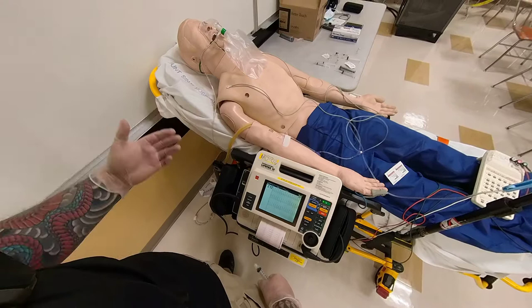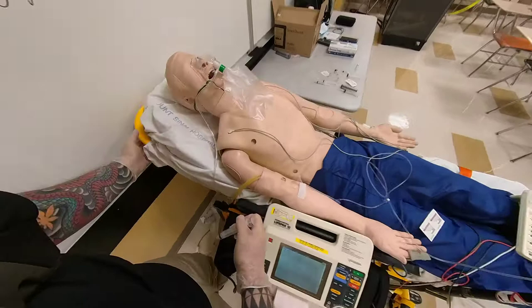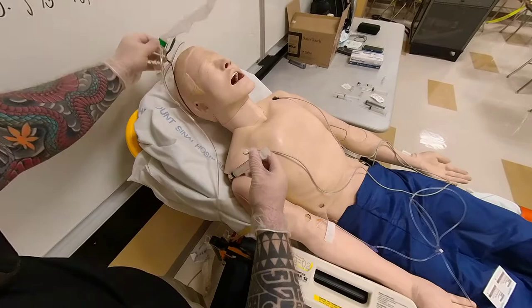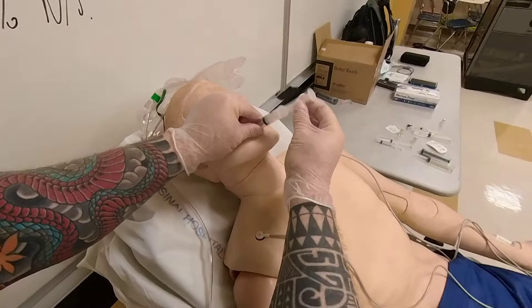The first step is we're going to try vagal maneuvers — and you're not going to ask your patient to bear down. What you want to do is give a syringe with no needle on it. You're going to have the patient seal their lips around the syringe and push out the plunger with their breath — force the plunger out — and they're going to do this procedure until the plunger is all the way out, or about 15 seconds.